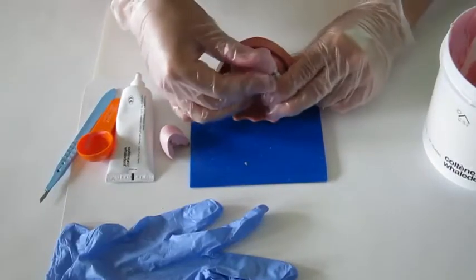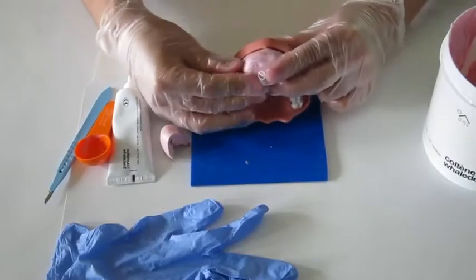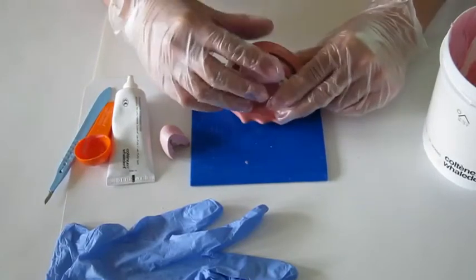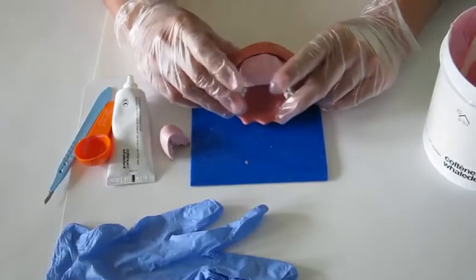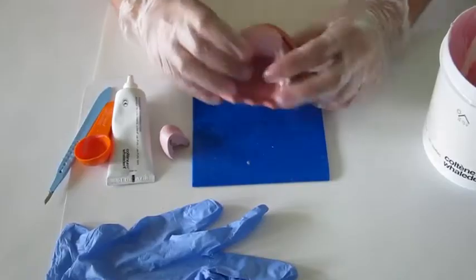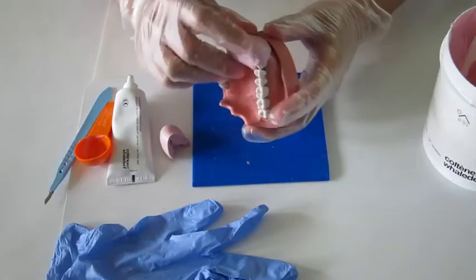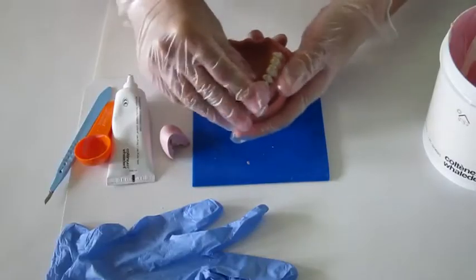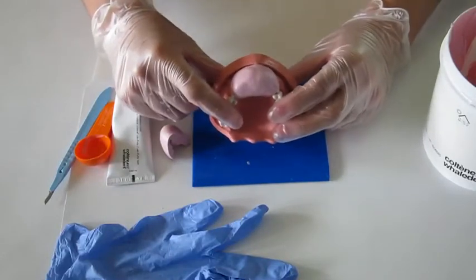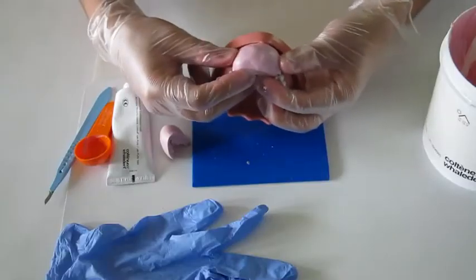Now I just gently press it onto the area so that we can obtain a precise impression of the tooth contour. Note that the index should be thick enough — do not exert too much pressure on the material making it too thin, as this will easily result in distortion of the silicone index when removing. The setting time is about three minutes at room temperature, but intensive mixing, high temperature, or overdosage of the activator will speed up the setting.